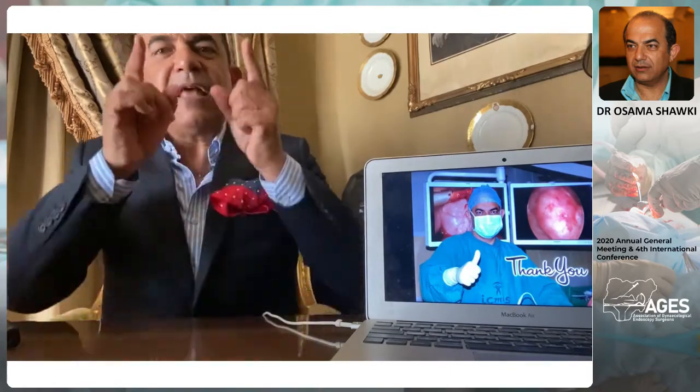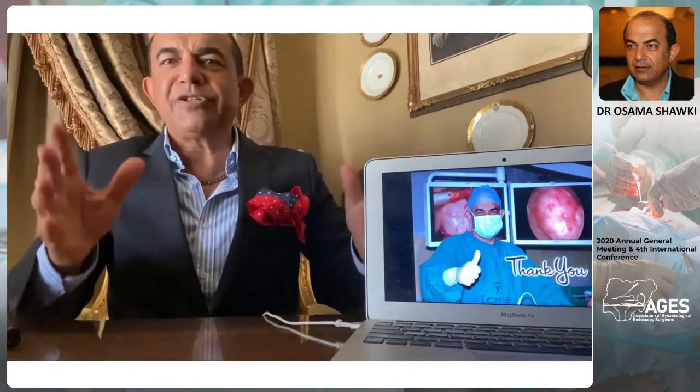So again, I wish you good luck and safe practice. Again, this type of big procedure is not for the beginners. 80% of the work is within the hand of everybody, like a small polyp, a very small myoma, less than 1.5 centimeter, a short septum. You can do it with whatever equipment, scissors or with a resectoscope. It is very safe. But for the big pathology, you have to readjust the settings and what we learned.